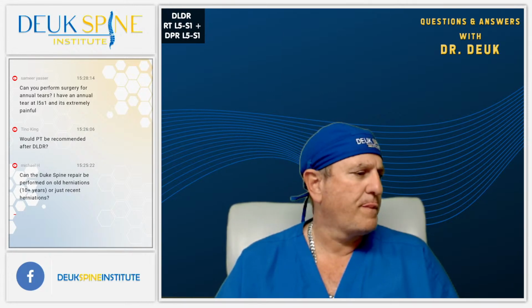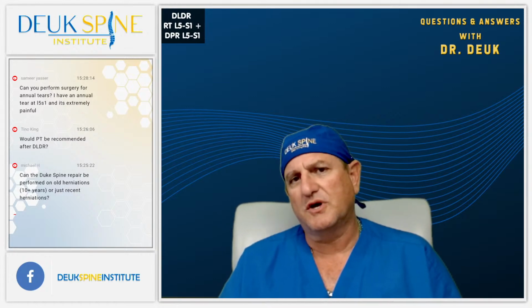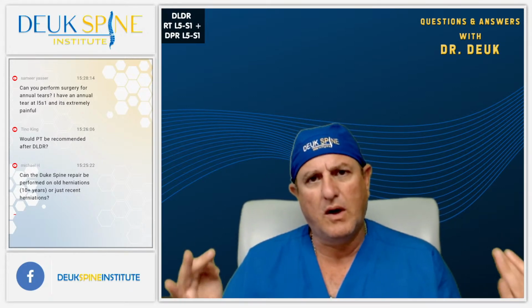Next question comes from Michael on YouTube. And they ask, can the Deuk spine repair, Deuk laser disc repair, be performed on old herniations that are 10 plus years, or just recent herniations? Hey Michael, great question. Can the Deuk laser disc repair, what you just watched done, can it be done on old herniations that are really degenerated? Absolutely. It works equally well, 100%.